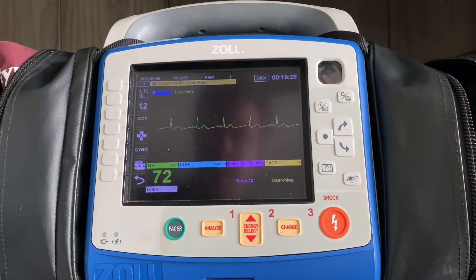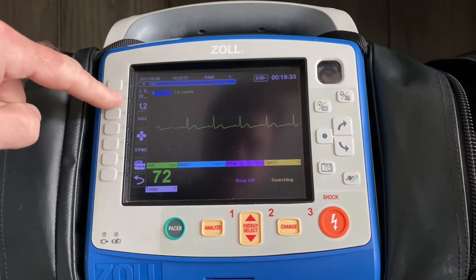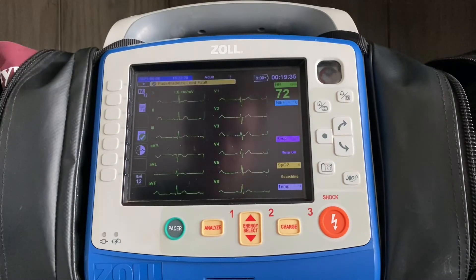If you care about more than lead two, you're going to hit the second button down, which is number 12, and that'll pull you into your 12-lead menu.